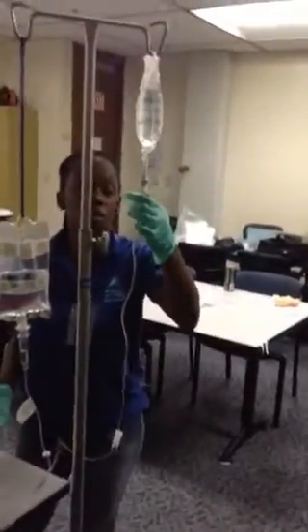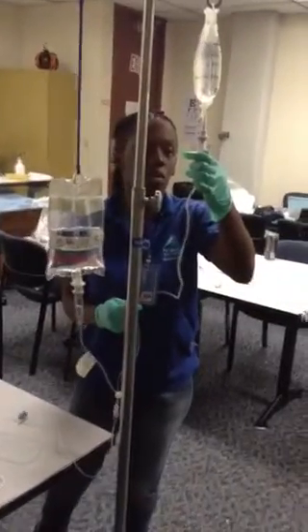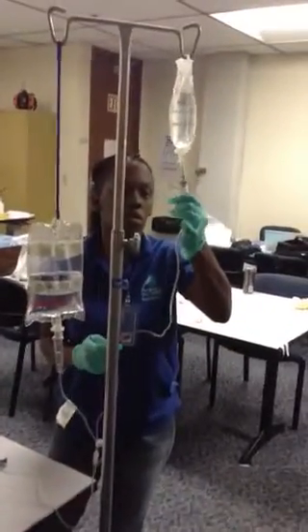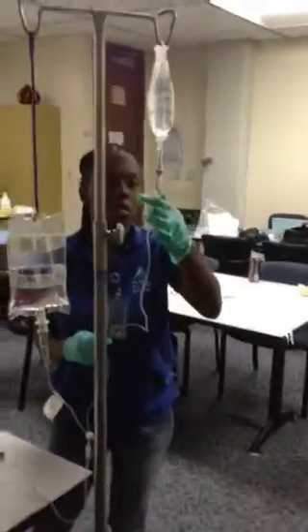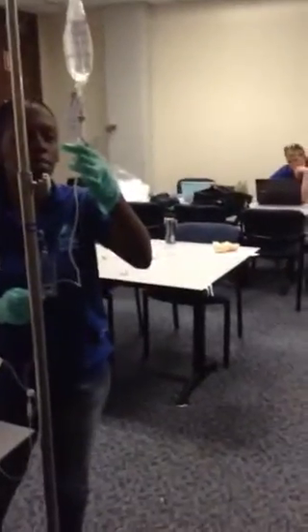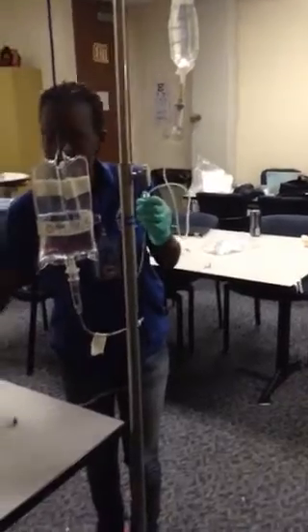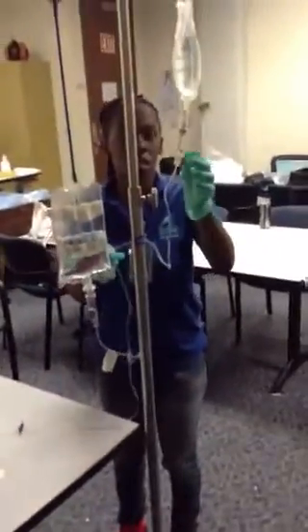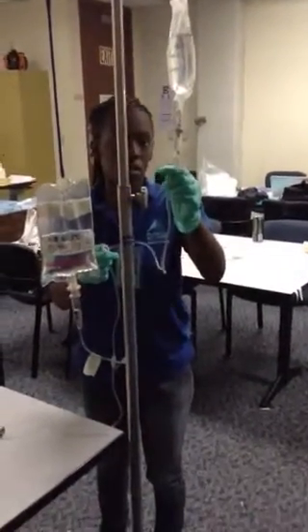It'll be one drop per every 3 to 4 seconds. This is unclamped, and then this is unclamped. We'll start the drops.